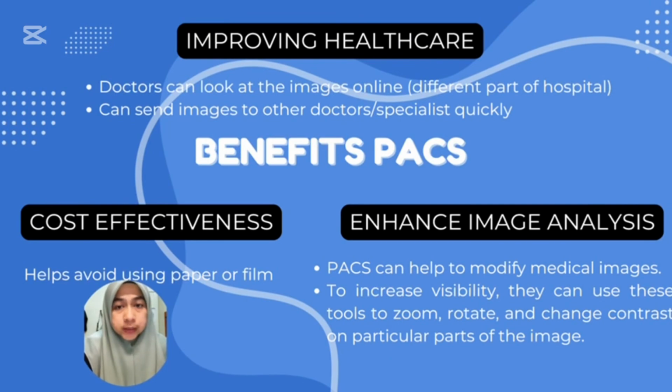First is to improve healthcare. Radiologists or doctors can look at the image online in a different part of the hospital. So this speeds up the diagnosis process and enables them to make quicker and better decisions and reports. Second is cost effectiveness. By eliminating the need for paper or physical film, the system reduces healthcare expenses, which also reduces the use of physical storage space.